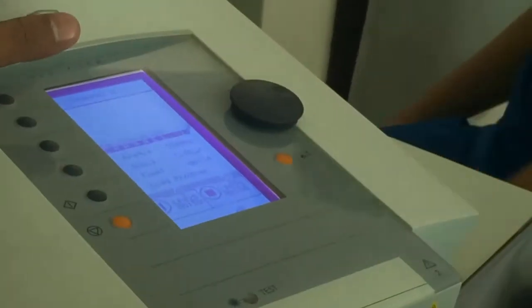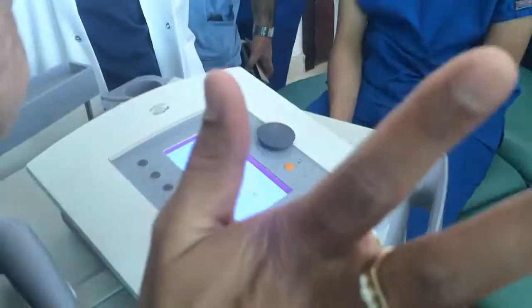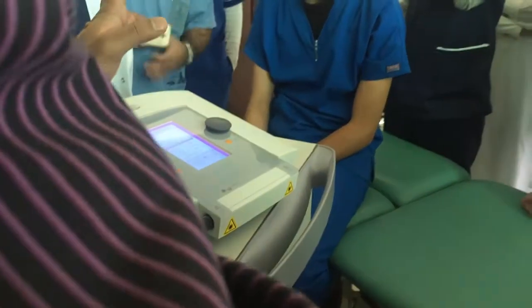Look here, please. According to the dosage, the time will automatically be set. You no need to put any time. Dosage is important. You should know what is the dosage given for the laser.